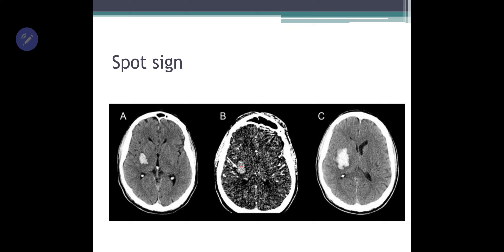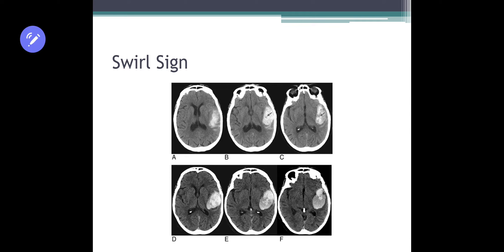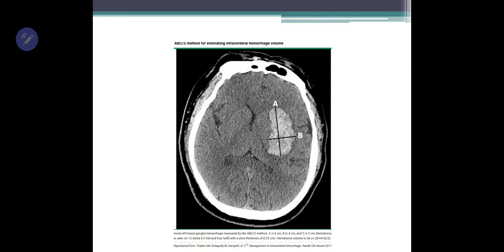The spot sign on CT with contrast signifies an active bleed. You can also see a swirl sign here — some hypodensity inside this hyper-dense area, like a swirl of hypodensity within the bleed, which also signifies ongoing hemorrhage.